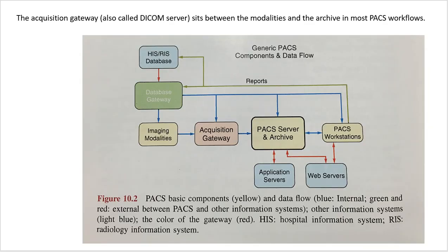So, the acquisition gateway, also called the DICOM server, and I will call it the DICOM server most of the time, sits between the modalities and the archive in most PACS workflows. This is a generic picture of the PACS workflow, but most importantly, you have the imaging modalities here. They send to the acquisition gateway, what I call the DICOM server, which then talks to the server and archive and stores the images that way.